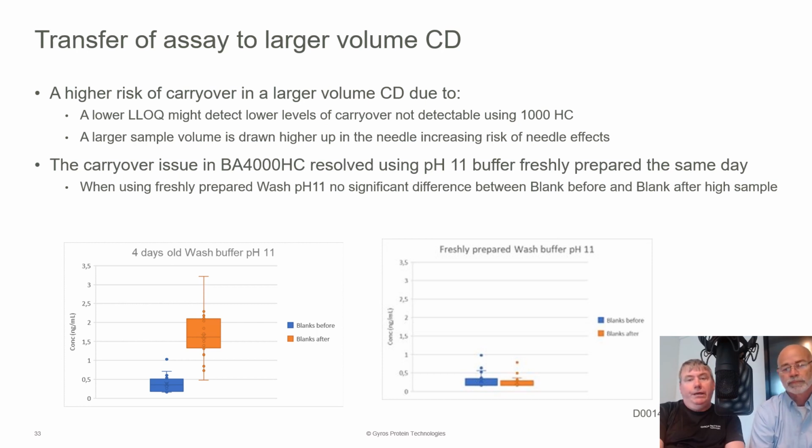rather quickly. Now if you look at the product information sheet for pH 11, it does indicate that sometimes a daily prep is required for some analytes. So it's not the majority, but a minority.